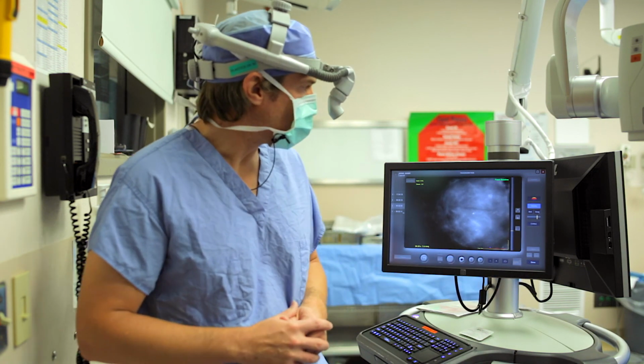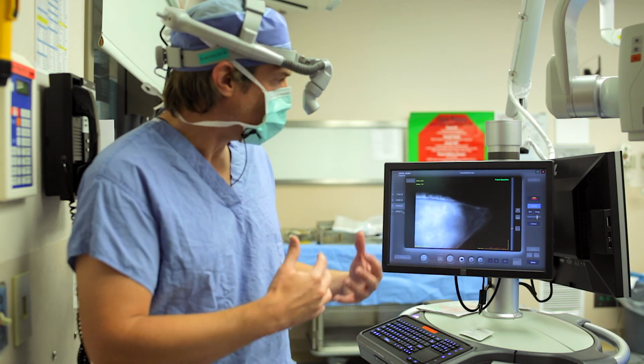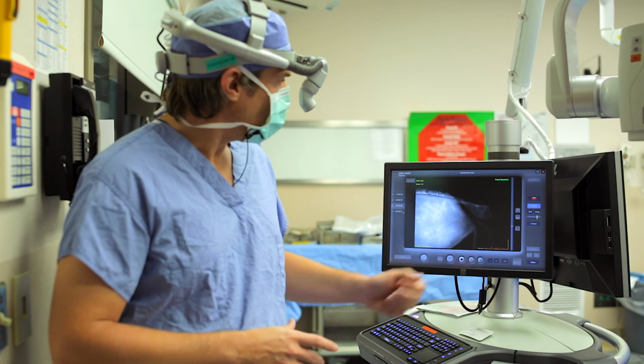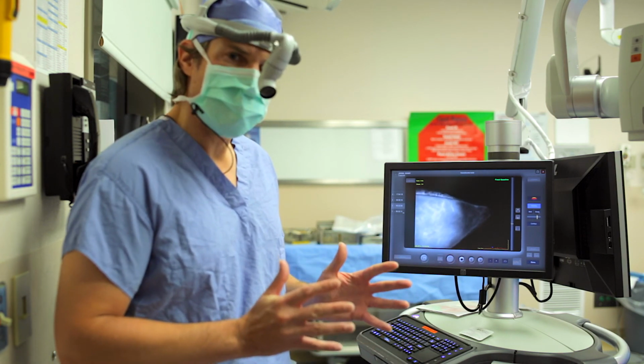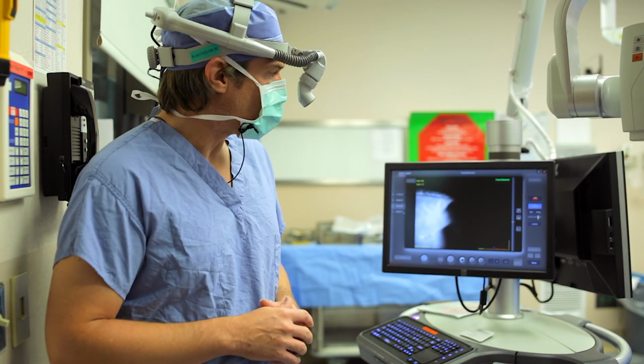And I take the contour numbers off. And again, now we're looking at this flap, deciding how much of it are we going to keep, how much of it are we going to discard. You can see me taking an ink pen, and I'm marking that lateral corner saying, you know what, that area isn't well perfused. We're going to remove that. We're going to discard that because later on, that's just not going to help us.